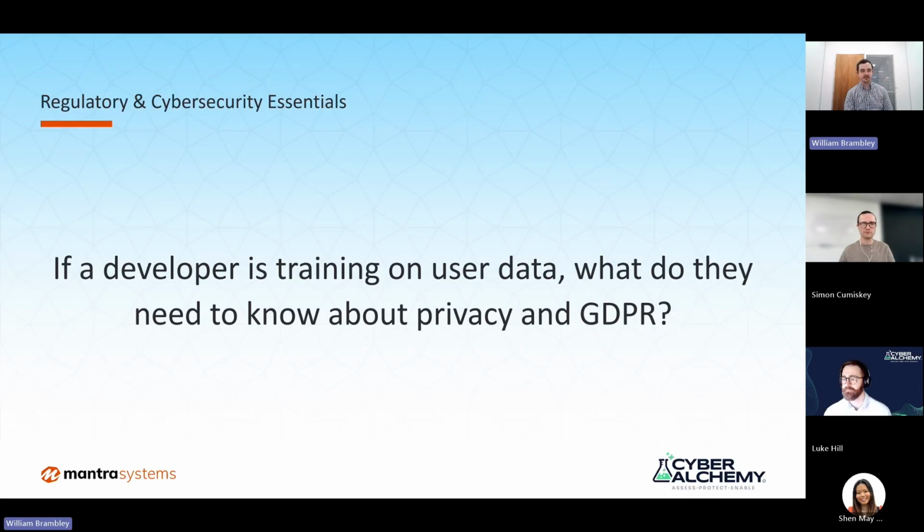Yeah, interesting. Simon? Yeah, I just want to add to that as well, sometimes it sounds like these things are just a nice to do, but it's really important to remember that when you want to CE mark your device and the notified body are looking at the way that you've developed this product and the way that you've tested this product, these are the sorts of questions that they're going to ask. This is the point at which they'll ensure that you've followed the applicable standards and regulations in both the development and the testing phase.